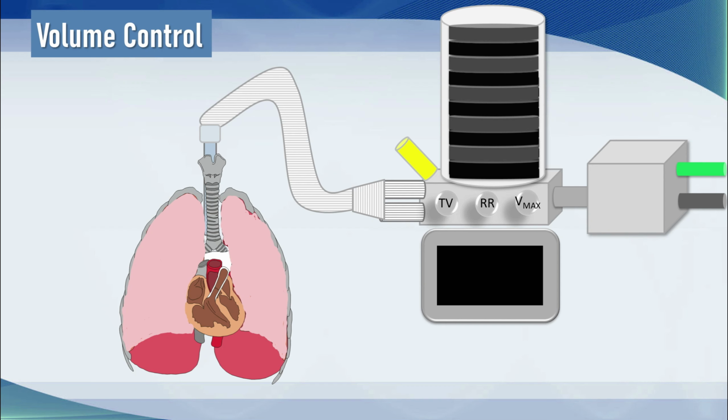You may or may not decide to set an inspiratory time for that patient. Normally, volume control is volume cycled. Once the gas goes in, it comes straight back out again. But usually these days, most doctors apply a slight inspiratory pause, so they time cycle the ventilator. If you work in the operating room, you will set an I/E ratio. By definition, you are time cycling the ventilator.